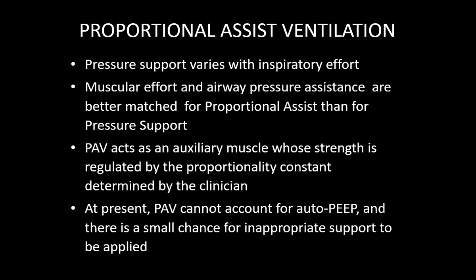Different companies have given different names to it. PAV is one. Then they have come up with PAV plus. Another company calls it proportional assist, or partial pressure support. So pressure support varies with the inspiratory effort. If the patient is demanding more, the ventilator will give more.